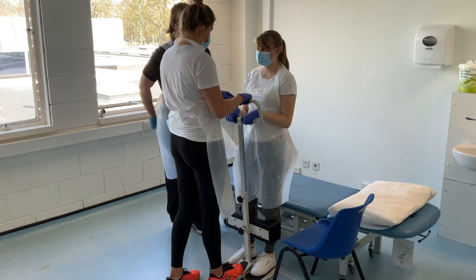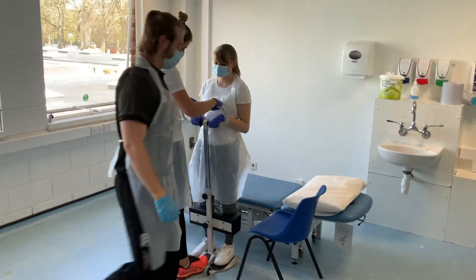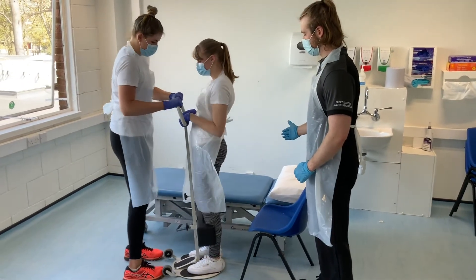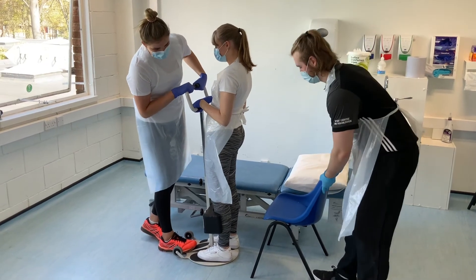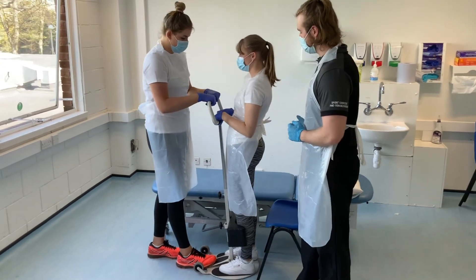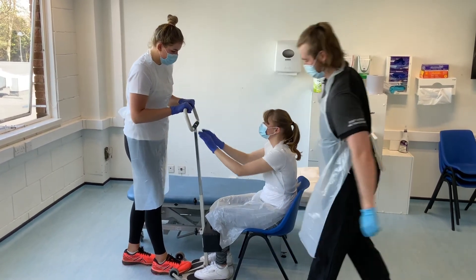How do you feel? Okay. So we're going to rotate you round to the chair. David's going to come round and support you. I'm just going to turn you. Do you feel alright? Yeah. Okay, so David's just going to move the chair ever so slightly behind you and then he's here to support you. When you're ready, I'd like you just to slowly lower yourself down. Lovely.